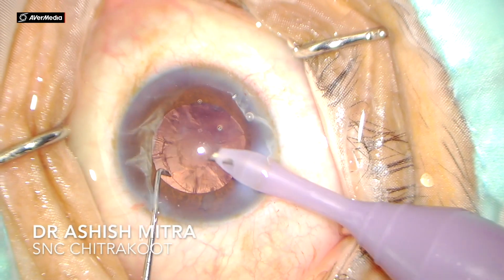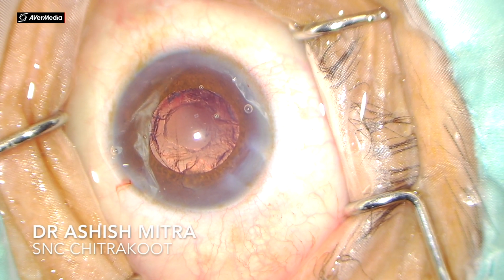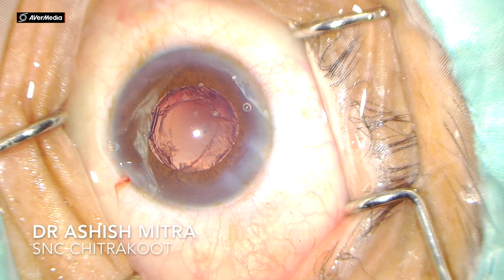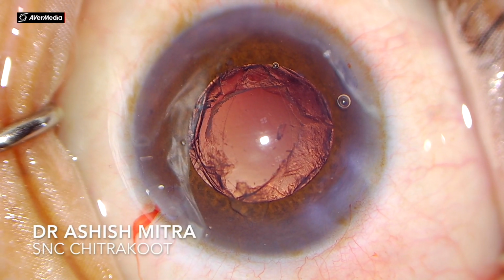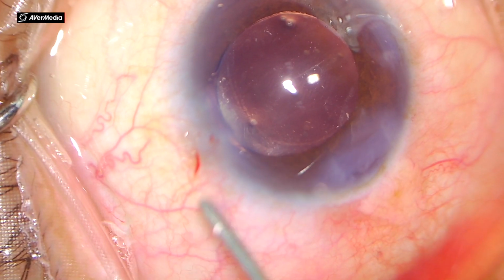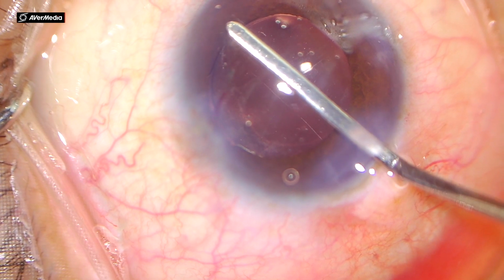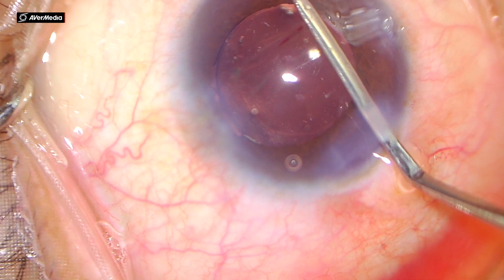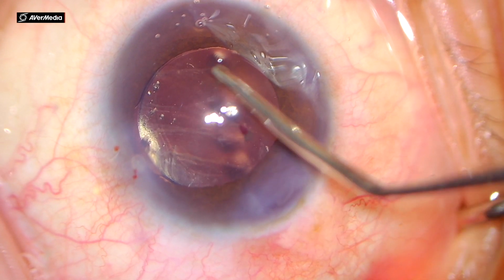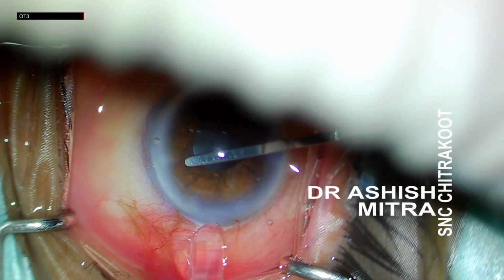Now this is a case which is very interesting. Just withdrawing the probe here, see that there is a PCR. So this is again a case which becomes challenging even though the phaco was almost uneventful. And just withdrawing, see the PCR is visible. Now this is another case, you can see the blood clot. There is some vitreous. I did phaco, the IOL was shifting to one side. And when I just noticed this blood clot, I found it fishy. And after bringing it in, see I am counting the vitreous strands, 1, 2, 3, 4. And this blood clot which was outside, that is now inside the anterior chamber.